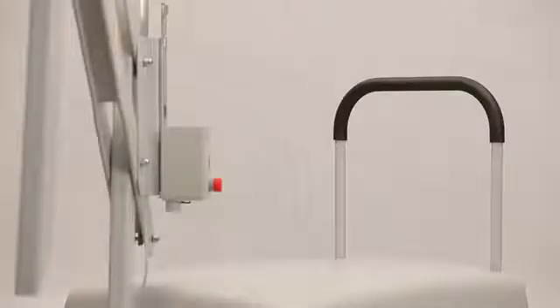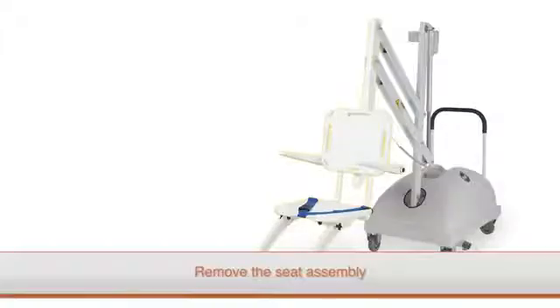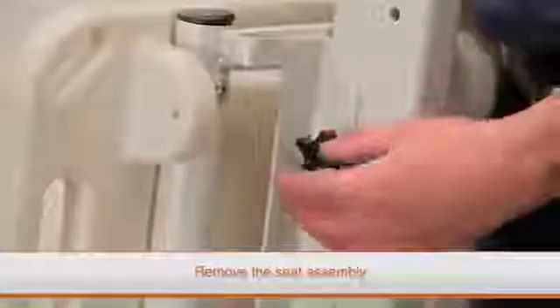On the PAL lift, you will need to remove the push bar. This is done by firmly gripping the push bar and pulling it up until it is free from its mounting pegs. Next, remove the seat assembly. Loosen the thumb nut on the bolt that attaches the seat assembly to the arm. Remove the bolt, then remove the seat assembly.